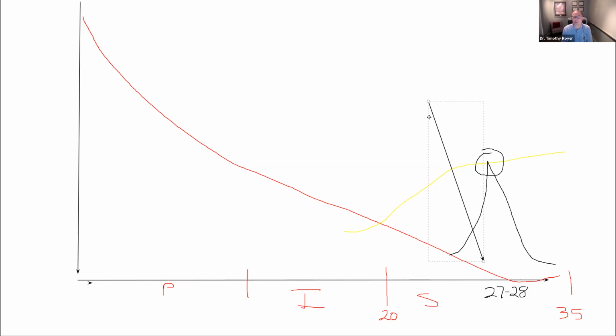And typically what happens is when they use that drug of choice, they might get a rise over here, okay, which then kind of dulls the senses, much like what we saw with marijuana, but in other ways. Alcohol can do this, maybe not as specific as the alpha frequencies. It may go down into delta and theta with alcohol, and other substances might do. A lot of the issues with pain medicines, those kind of things, is they're trying to dull these responses down here and create a heightened, slow response.